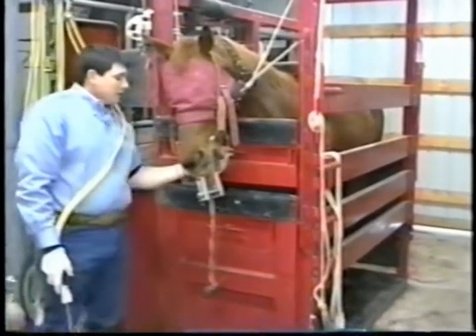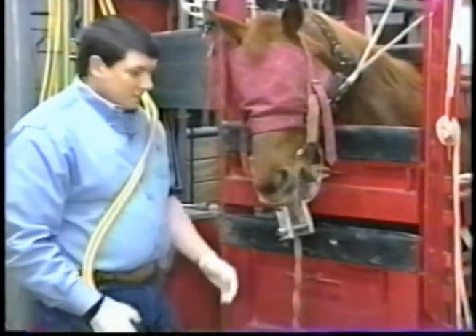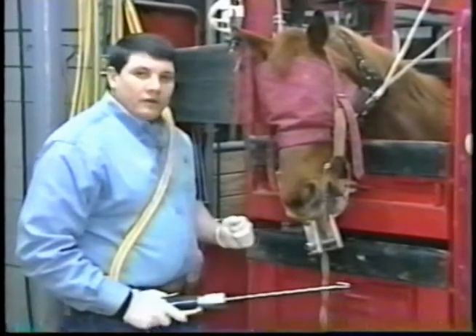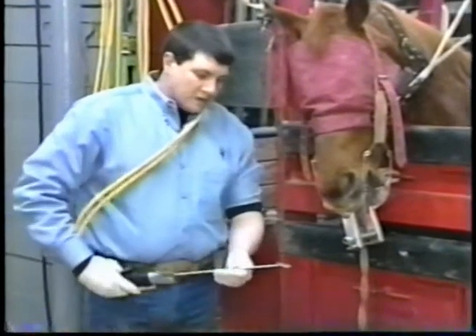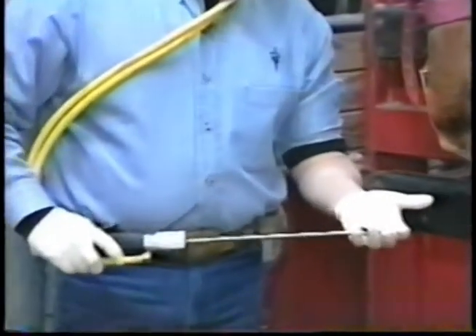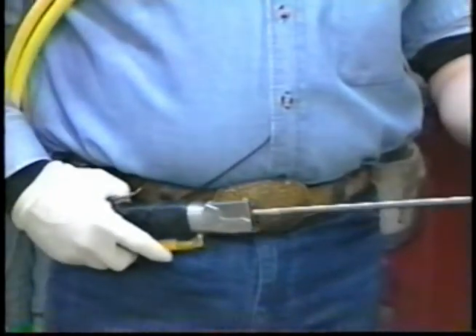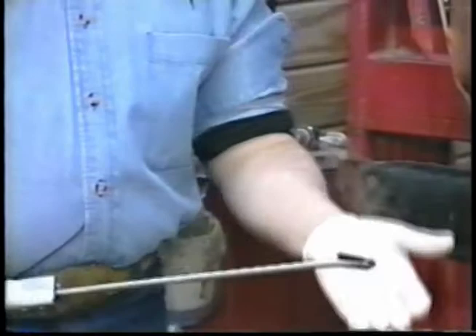Once we've made the inspection of the mouth, we have an idea of what we need to go fix. The object now is to be able to do it with as little trauma to the soft tissue as possible. The quarters are pretty tight within the mouth, so we've developed instrumentation that allows us to work each individual tooth while protecting the soft tissue and knowing where the instrumentation is at.